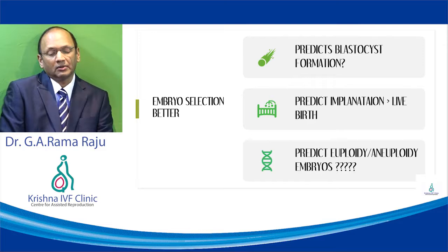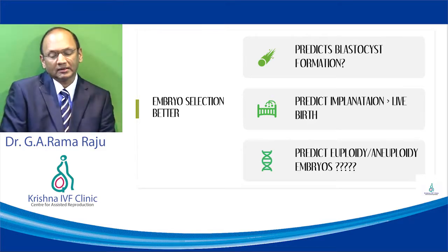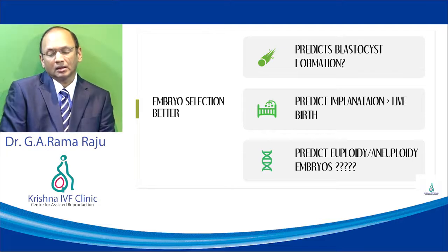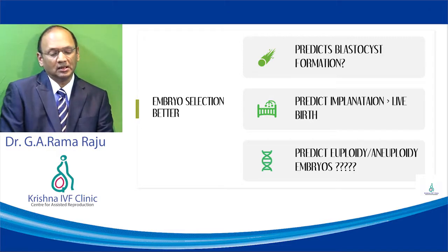So, the summary is, it predicts blastocyst formation. The data is at the moment divided on whether it will give a good prediction of live birth. Regarding replacing pre-implantation genetic diagnosis as a tool, I am not sure, the data is not complete.